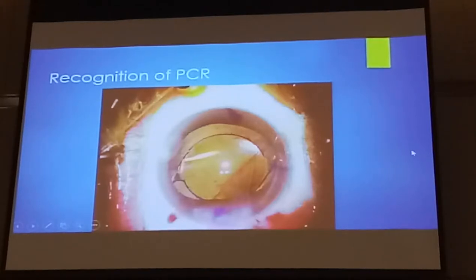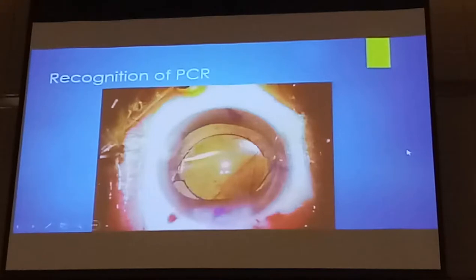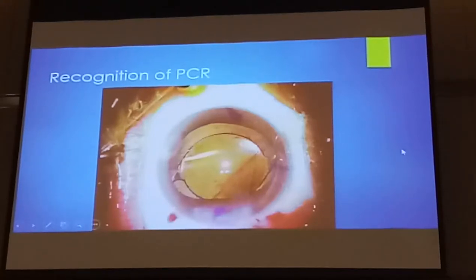Sometimes it doesn't drop like what was shown earlier. It's just obvious but then you say nothing happened and you continue the phaco. But I knew it was just not normal. You just need to be very careful and decide whether to continue, because you don't want to disbelieve your eyes.